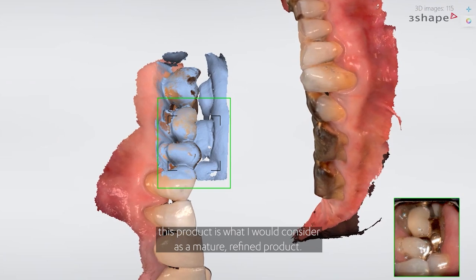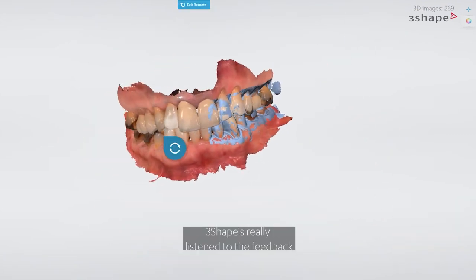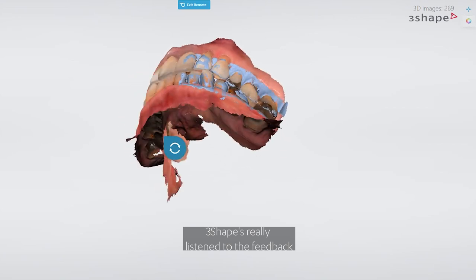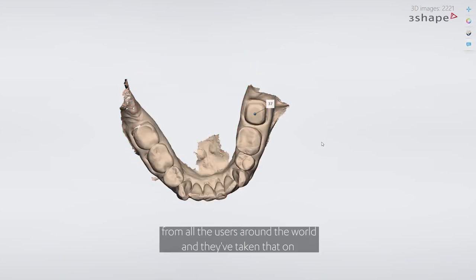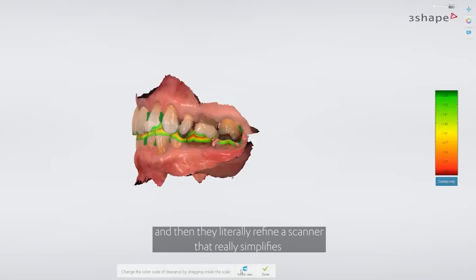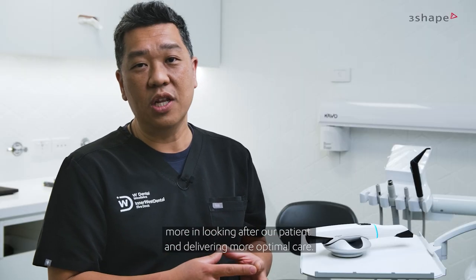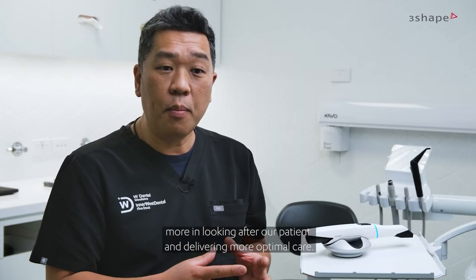We can come into work and basically just pick up the scanner and start using it. I have to say that this product is what I would consider a mature, refined product. 3Shape has really listened to feedback from users around the world and literally refined a scanner that simplifies what we do in dentistry, allowing us to concentrate more on looking after our patients and delivering more optimal care.